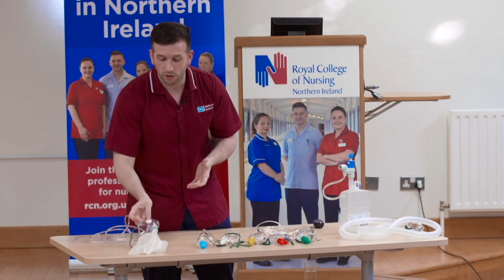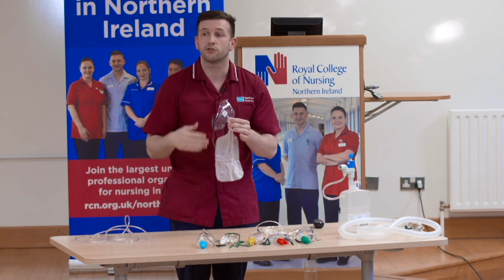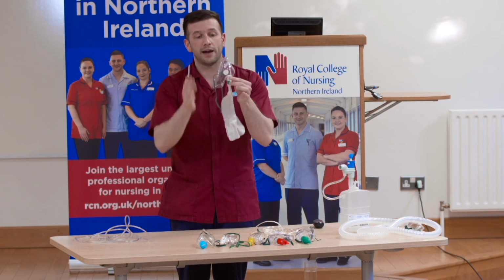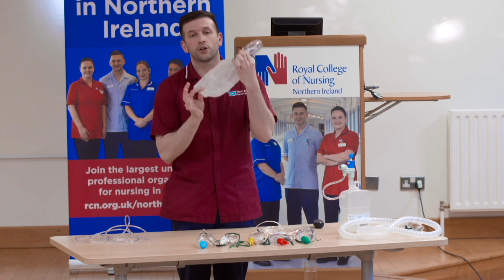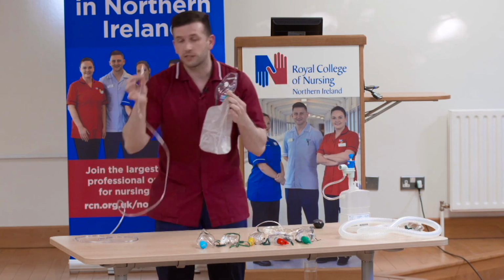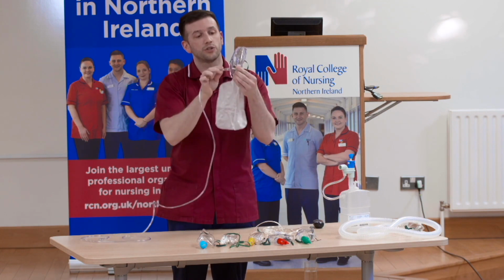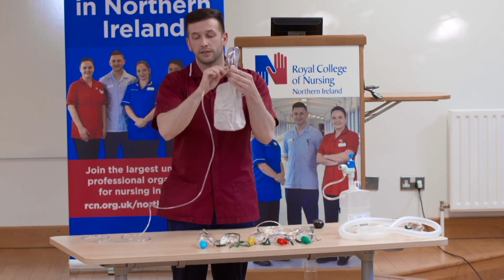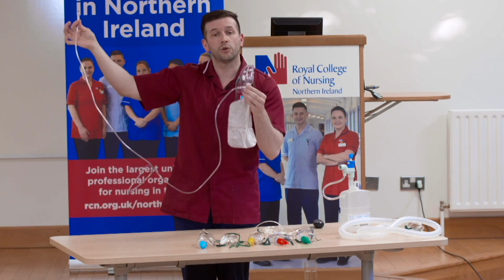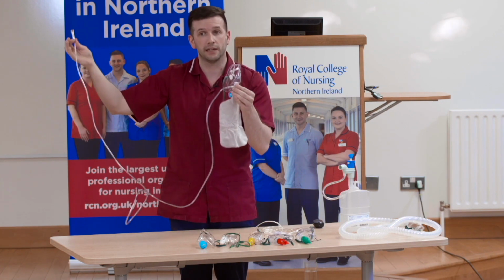Whenever you're using this oxygen interface, and remember, this will be for critically unwell patients who require high flow oxygen therapy, when you open the packaging, you're going to find your interface connected to a reservoir bag. There will also be some narrow bore oxygen tubing. The first thing to do is to connect the oxygen tubing to the side of the interface. Then you'll connect the oxygen tubing to your oxygen flow meter, and you'll turn it to between 10 and 15 litres.